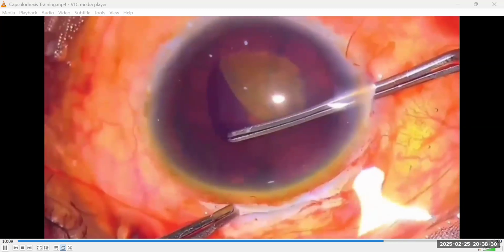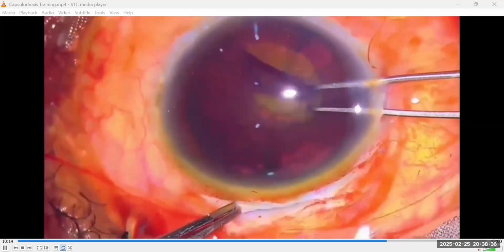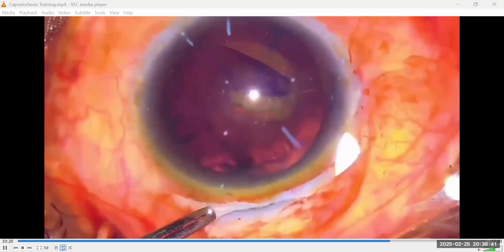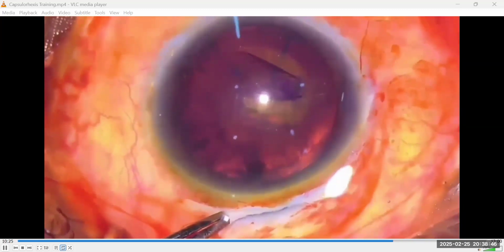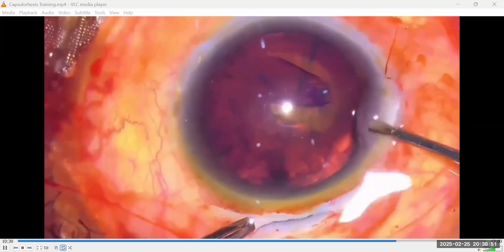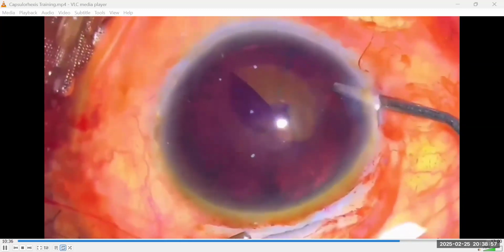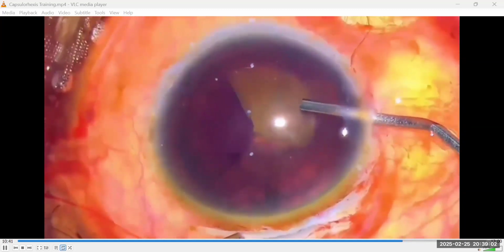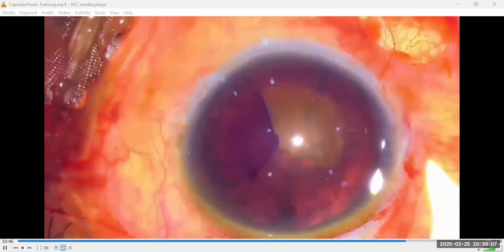So I'm looking at the tear. Apparently, the instrument leaves the flap. Beautiful. I noticed shallow AC. I have to repressurize. Visco is cheaper than corneal endothelium. Look at my desired perimetry for the rhexis. That coincides with a shallower part of the anterior chamber, so the knuckle of my instrument can be destroying the endothelium as I am going round.